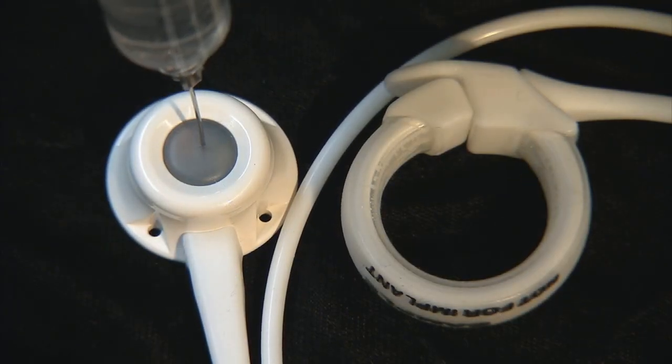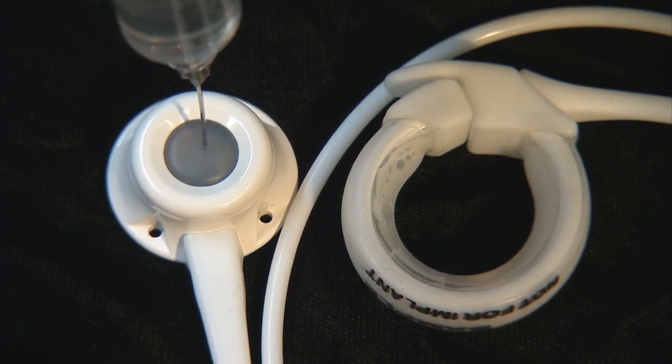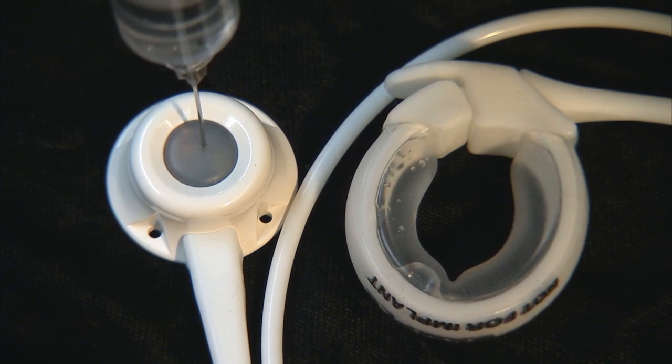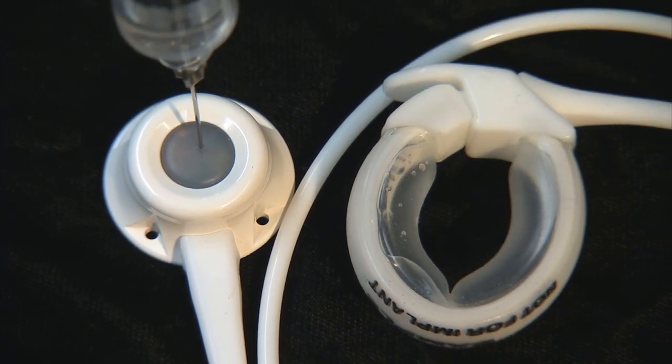This is a 10 centimeter laparoscopic adjustable lap band. You can see the ring in the center with the balloon completely deflated. Now you will see saline being inflated into that balloon one cc at a time: here's one cc, two cc's, three and four. The maximum volume of this balloon is four cc's. And now it's being deflated.